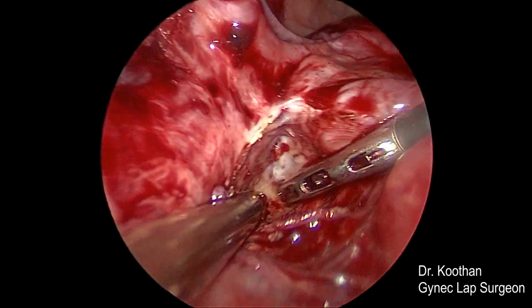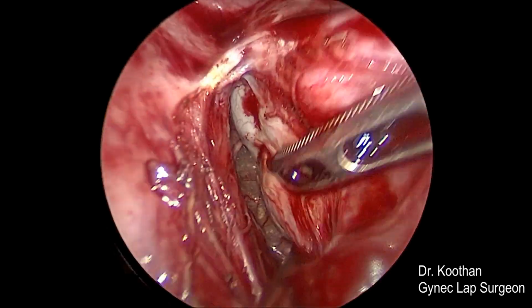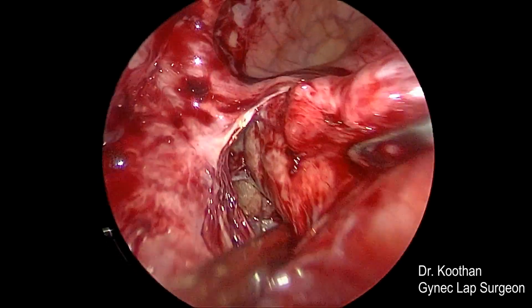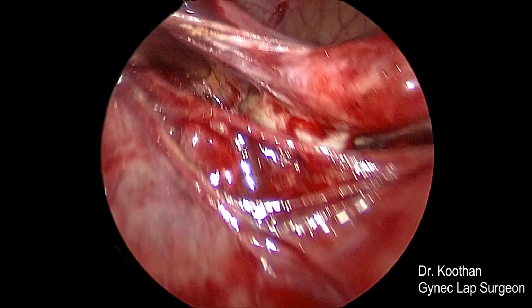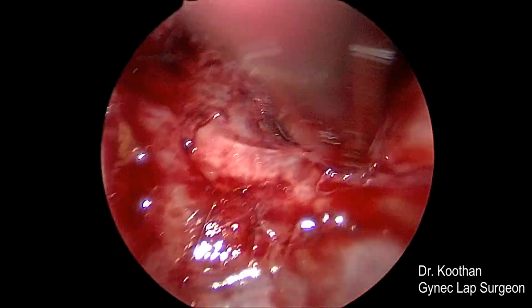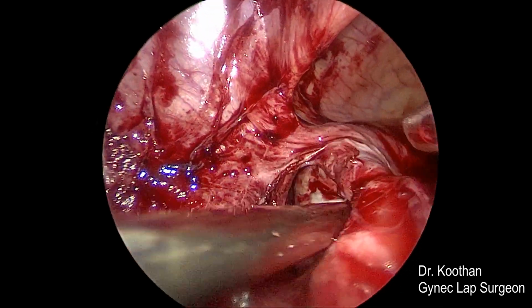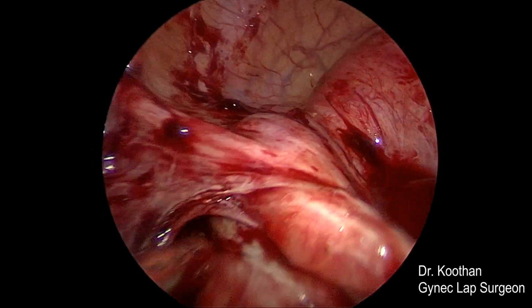Now we have opened the lateral pelvic wall, and you can see the other side of the Pyosalpinx. We are dissecting into the lateral pelvic wall. Above you can see the round ligament. The lateral pelvic wall attachments are completely released from the Pyosalpinx. It's a huge Pyosalpinx. So releasing the adhesions from the round ligament.